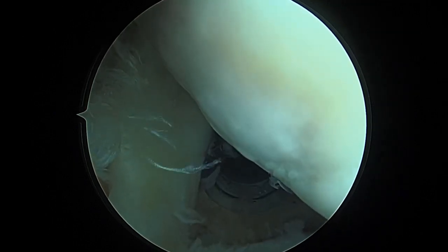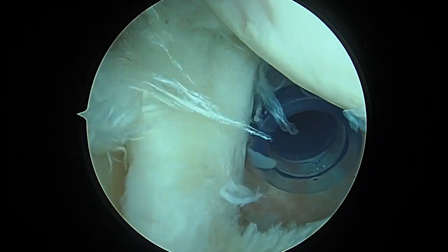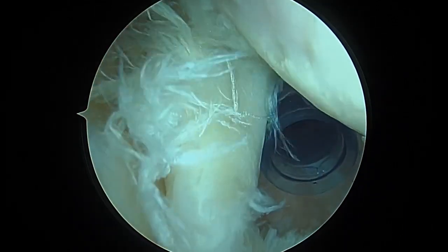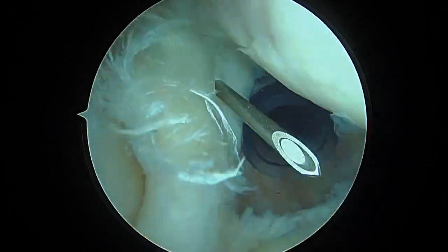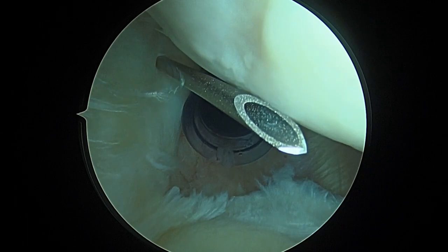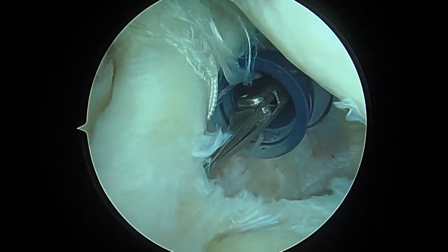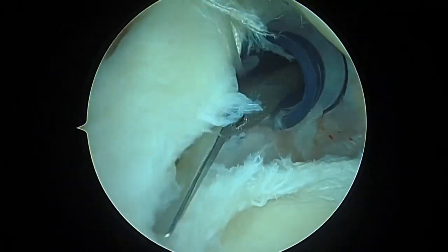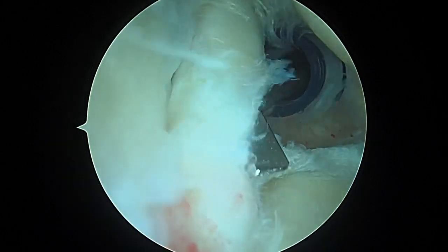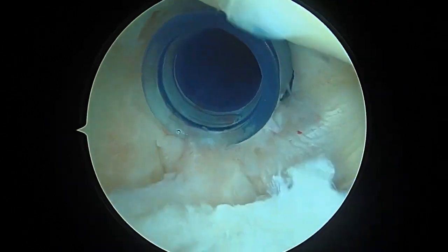We'll take a shuttle relay and pull it out of the spectrum handle. All we're trying to do here is pass this basically right through the middle of the biceps — it goes around and through twice — so that gives us a real good hold on the biceps. Now we're going to go ahead and release it so that it can't continue to tear down here inside the joint, because that whole process causes pain. Now we've released the biceps; you can see it's no longer attached at the top of the space.